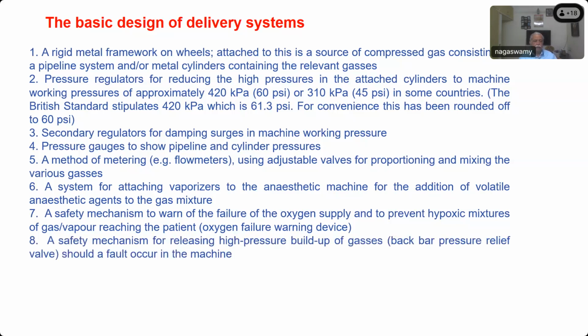And the buildup of high pressures inside the circuits is prevented by the pop-off valve, which can easily let out any high pressure. What is the maximum safety pressure above which the pop-off will release? This is another common question in the examination.